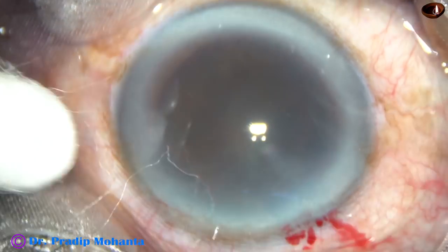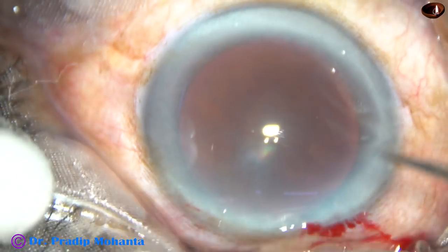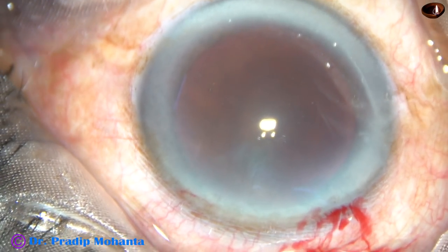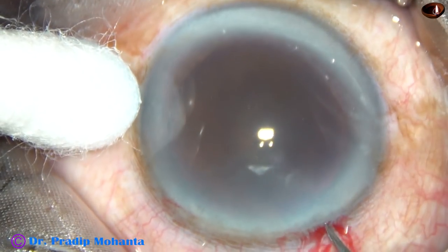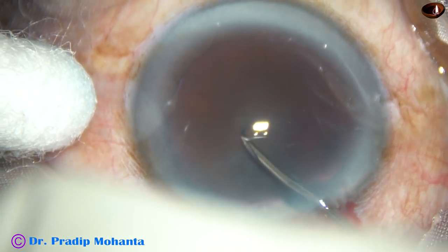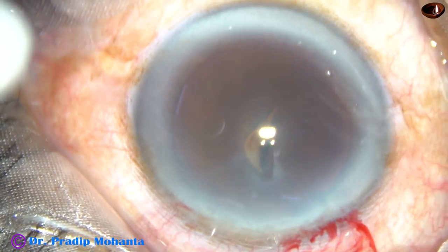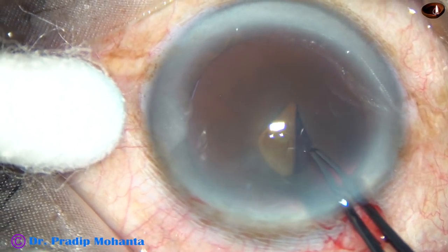By this time, the main incision and paracentesis on the left side of the main incision have been made. The anterior capsule has been stained with trypan blue dye. Viscoelastic substance has been injected into the anterior chamber. Now the anterior capsule is incised with a 26 gauge needle, and the capsular tag is raised. I hold this capsular tag with the utrata forceps.